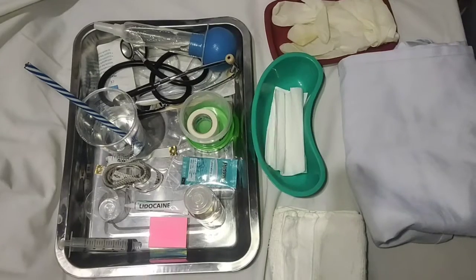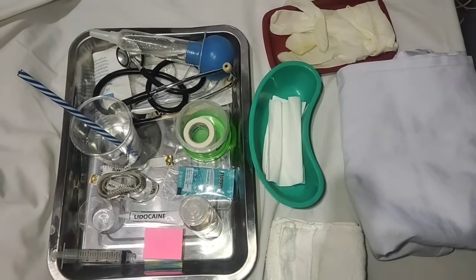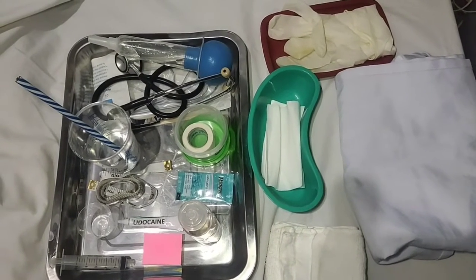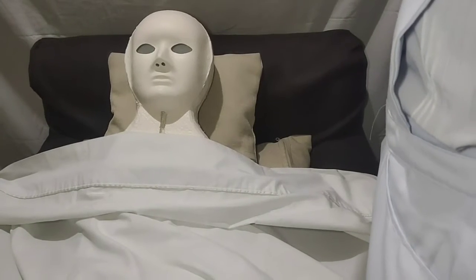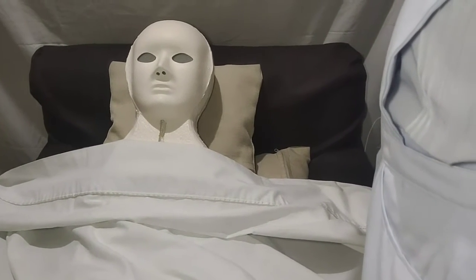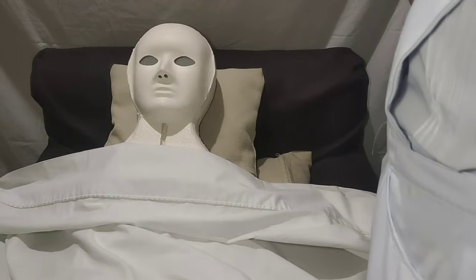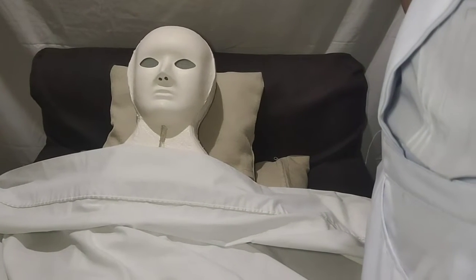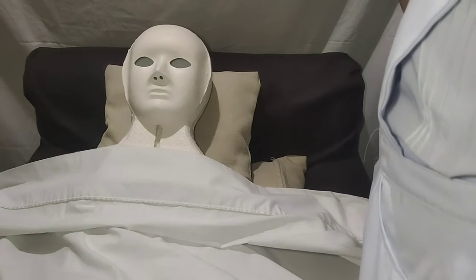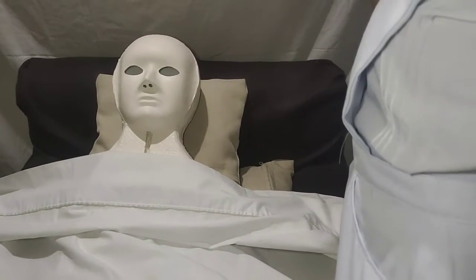Okay, ma'am. Of course, gather all the equipment appropriate for the nasogastric tube insertion. The rationale for doing this is to have them readily accessible during the procedure. Close the patient's bedside curtain or door. Raise the bed to a comfortable working position, usually elbow height of the caregiver. Assist the patient to high Fowler's position, or elevate the bed 45 degrees if the patient is unable to maintain the upright position. Drape the chest with a bath towel or disposable pad. Have an emesis basin and tissues at hand.